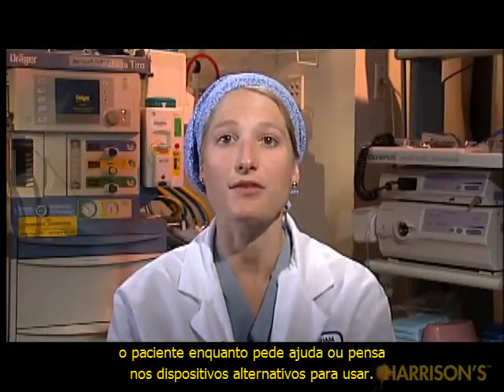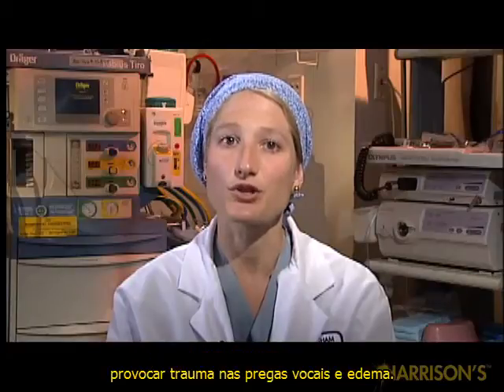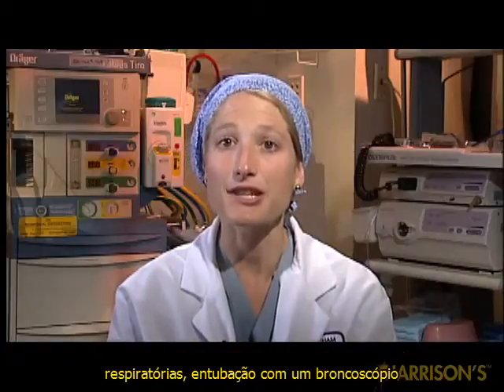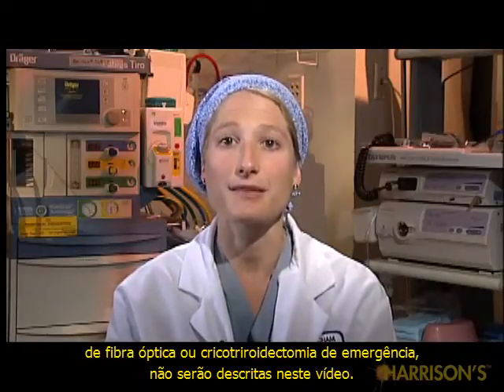If the cords are not well visualized, it is important to mask ventilate the patient while calling for help and thinking of alternative devices to use. You should not repeatedly try direct laryngoscopy, as this can cause cord trauma and edema. Alternative strategies, including placement of a laryngeal mask airway, intubation with a fiber optic bronchoscope, or emergency cricothyroidectomy, will not be covered in this video.